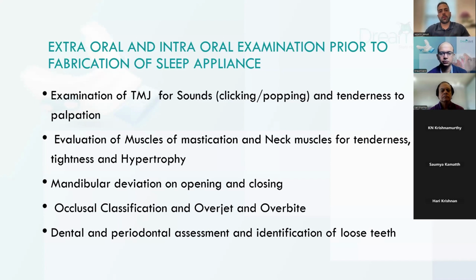And then as we are moving the jaw to a more forward position, we're going to put a little bit of strain on the TMJ and muscles, we are doing that within the range of normal for the patients, and it can be something that they can get adjusted to. So what we do, we're going to check the TMJ for any clicking, popping, tenderness, palpation. And a lot of times I also ask patients if they had a history of clicking and popping, because sometimes the patient may not experience it right away that day in the chair, but they may tell you that they used to have that. So that's also an important factor to note.